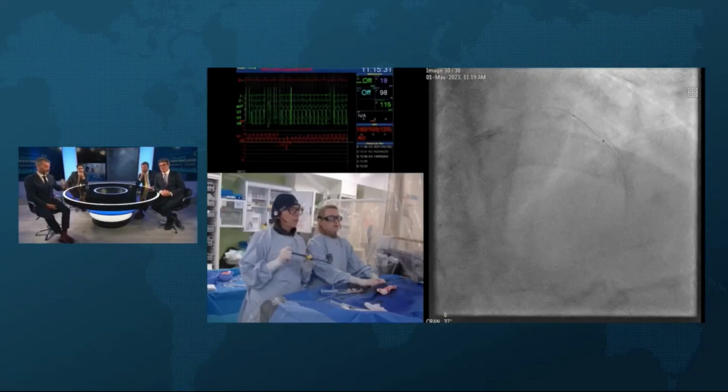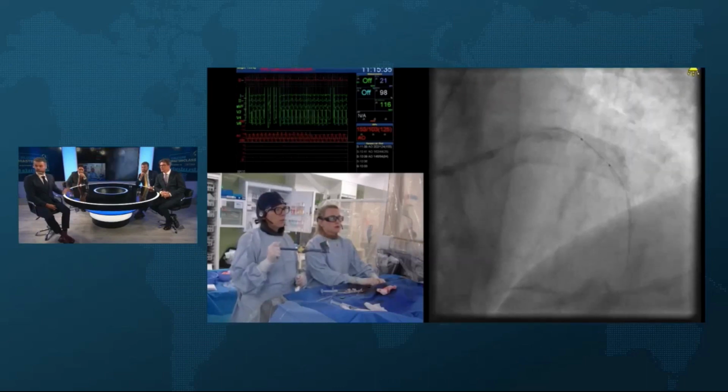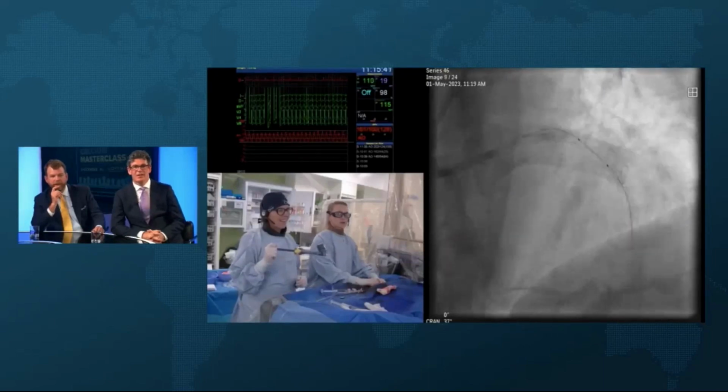Yeah, we could re-IVUS. Yeah, please. It'd be interesting to see the distal vessel. I think you just saw a hand there because the pulse pressure got a bit low. That's a bit of blood pressure. Yeah, I've backed everything out again. He'll be all right.